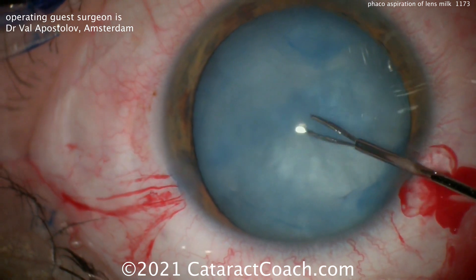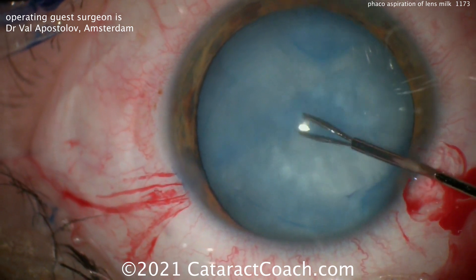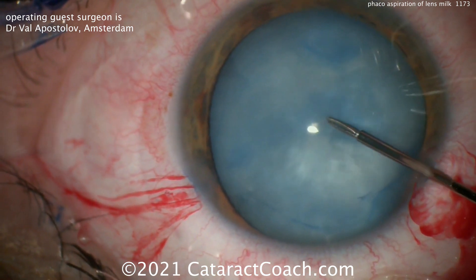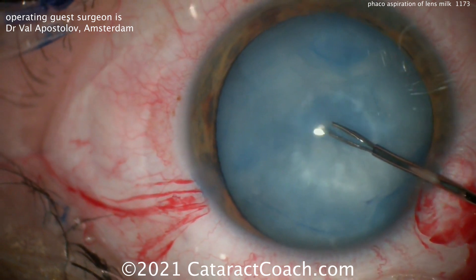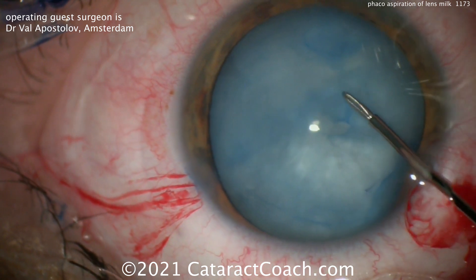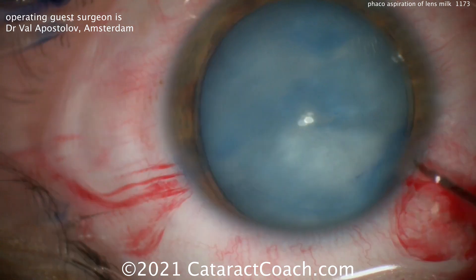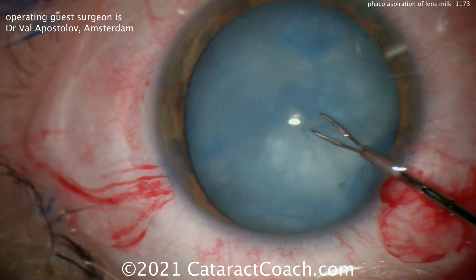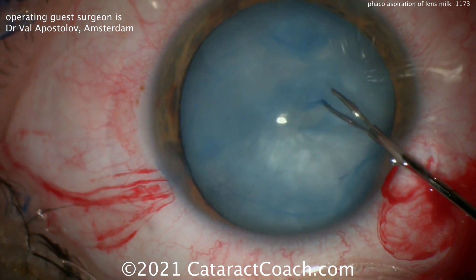You're able to aspirate enough of that liquefied cortex, that milky fluid, so that it's less pressurized. As he starts the capsulorhexis, the capsular bag has been depressurized. You can see the reflection of the light and how it creates an indentation — this capsule is not at any risk of running out.